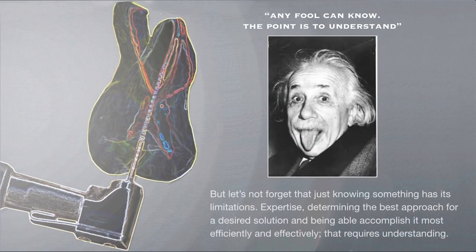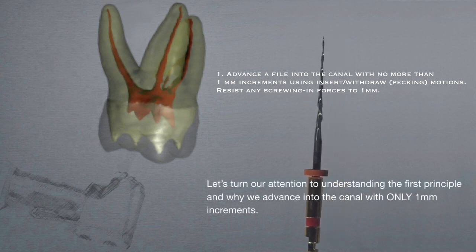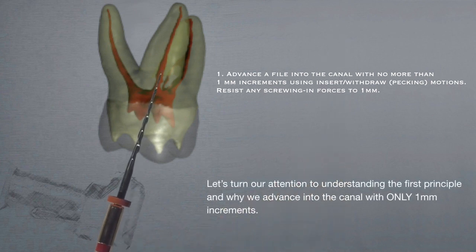But let's not forget that just knowing something has its limitations. Expertise, or determining the best approach for a desired solution and being able to accomplish it most efficiently and effectively, that requires understanding. Let's turn our attention to understanding the first principle and why we advance into the canal with only 1 mm increments.